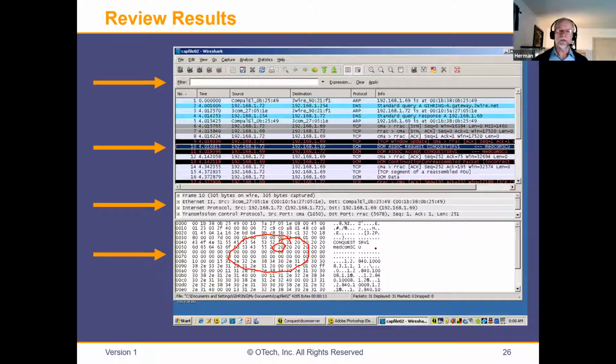Another reason I sometimes use the raw data is to cut and paste, if I have some other protocols. Now here's the second window, and what do we see here? Frame, Ethernet, Internet, TCP. We're not interested in all of the different packets, though if you're curious, you can click on them and look at them. Basically we look at the TCP/IP protocol, and then at the top, the application level commands.